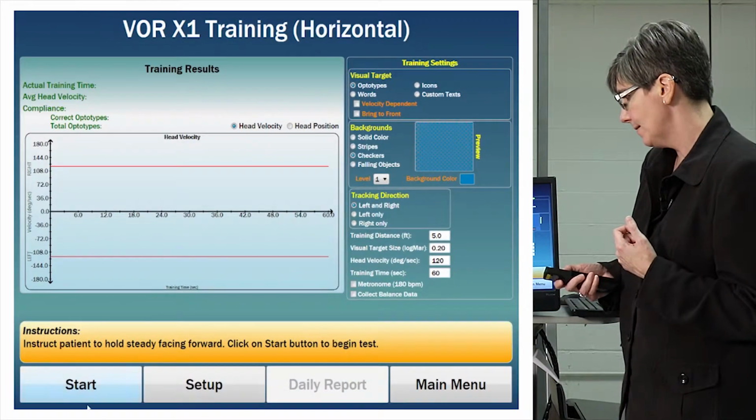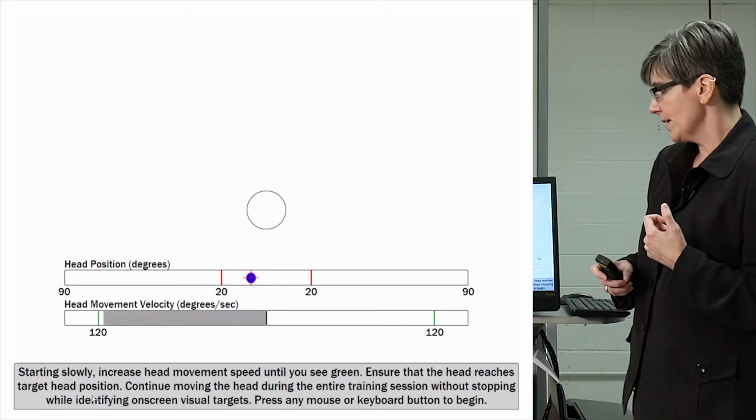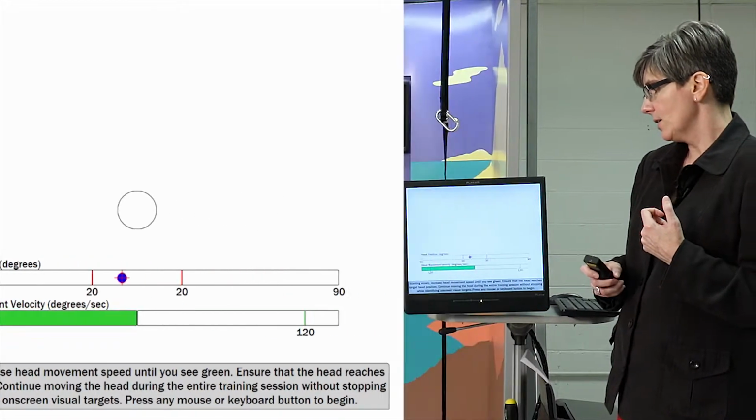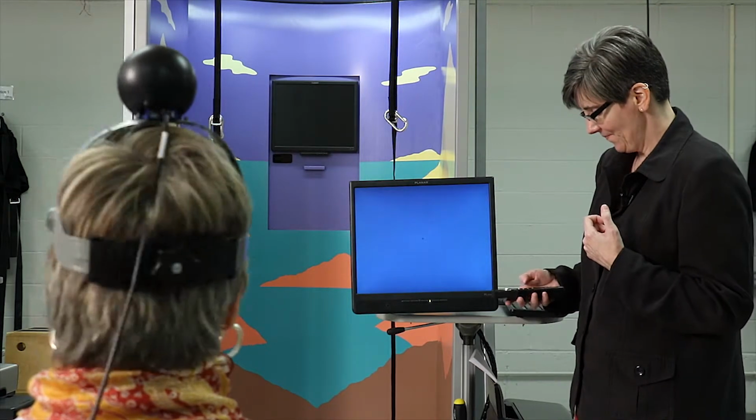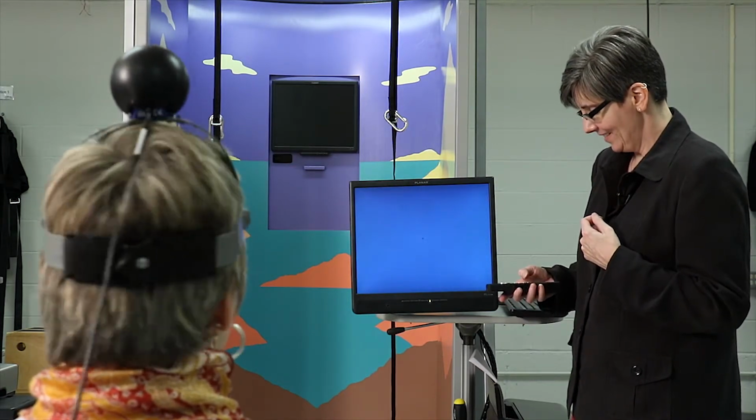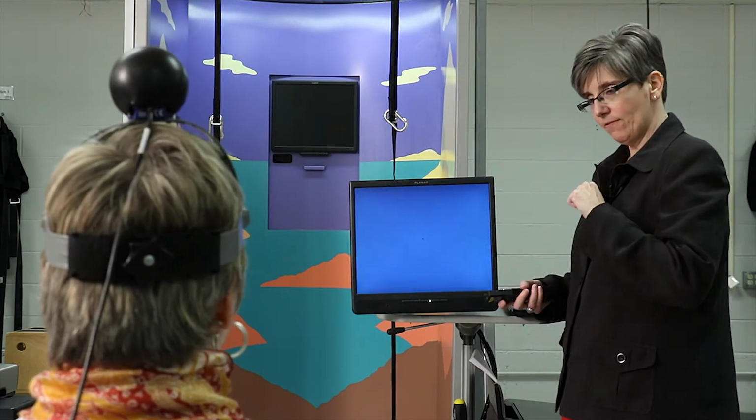Mary, are you ready? I'm ready. All right, we're gonna start. Go ahead and practice. Great. Up, up, right, right, down. Great. Stop, Mary, perfect. You're doing great.